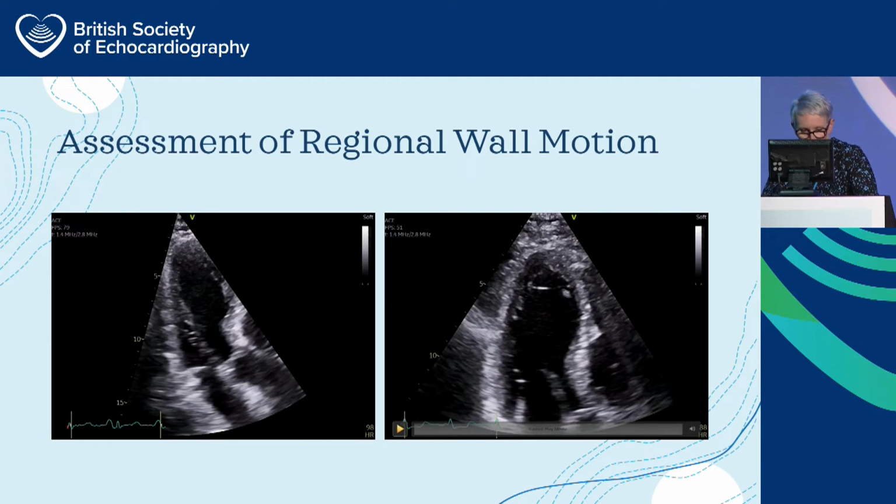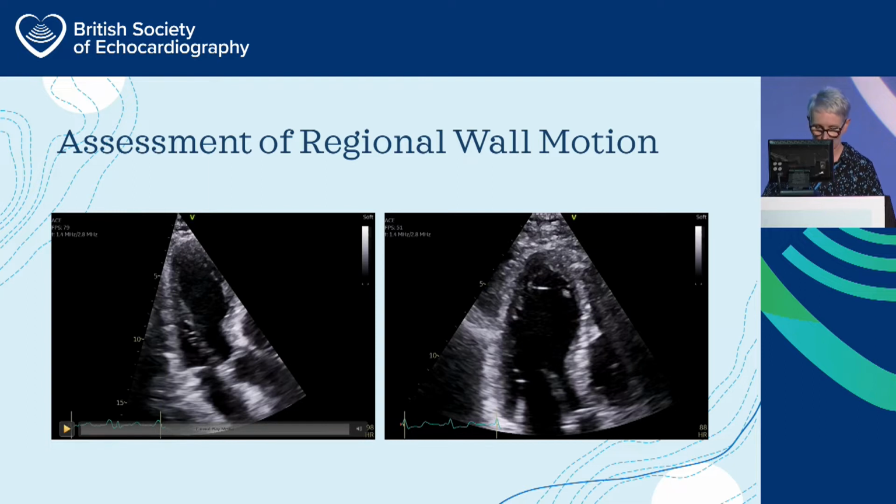Basically, in this view, the whole of the anteroseptum, to me, looks akinetic. You may well have to take my word for it. And basal and mid infralateral looked okay in this view. Is it going? No. Let's move on.